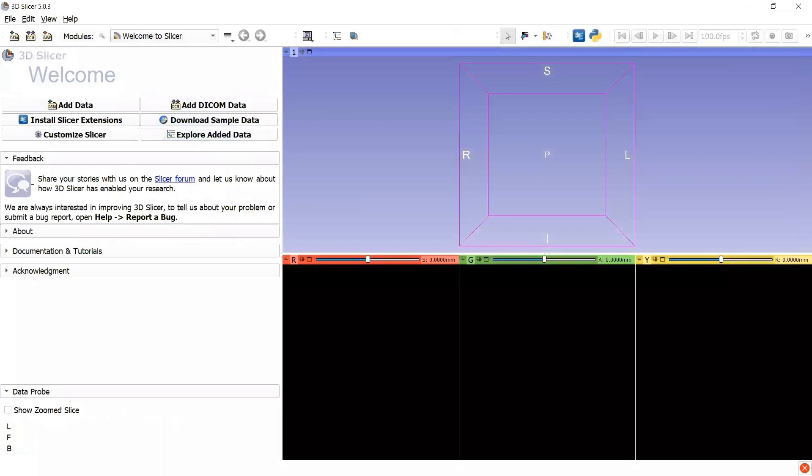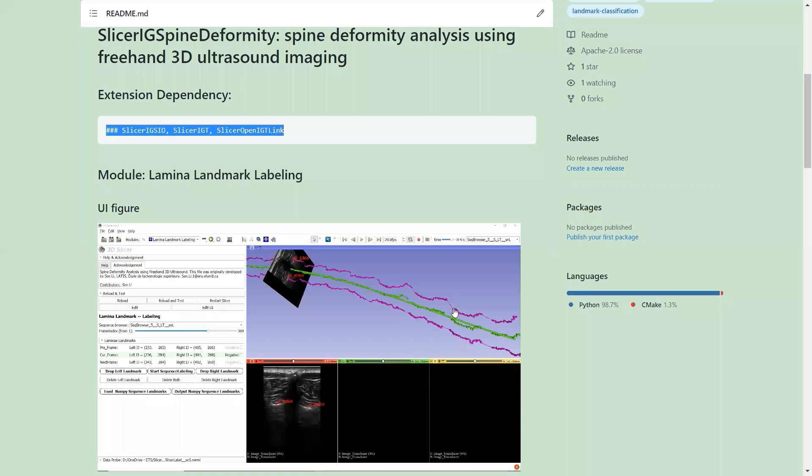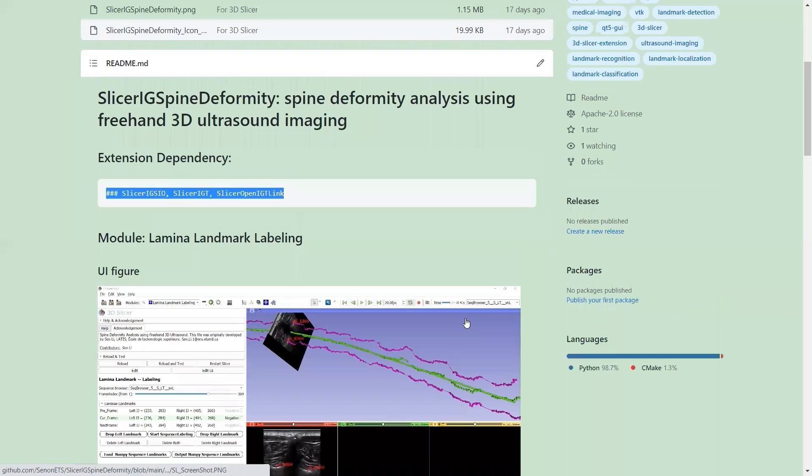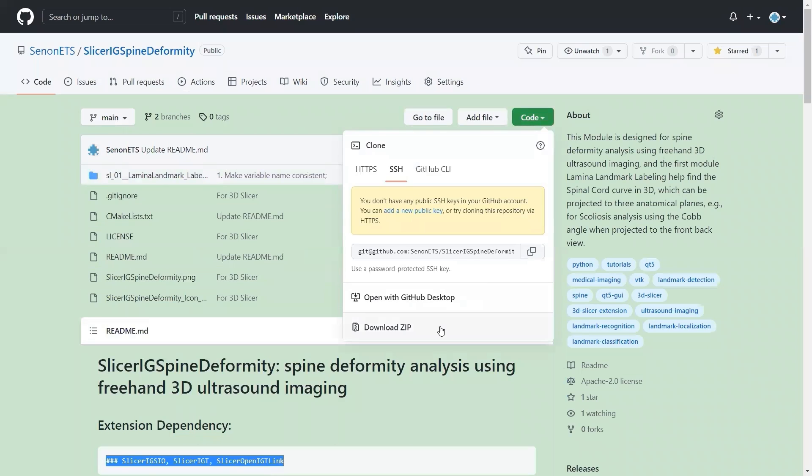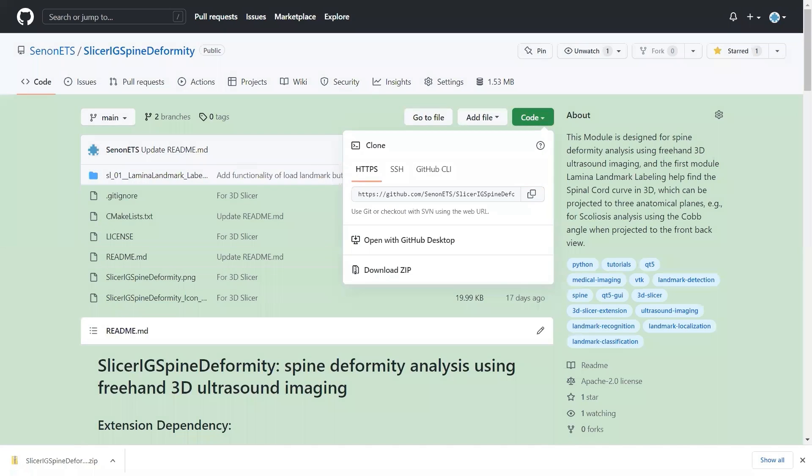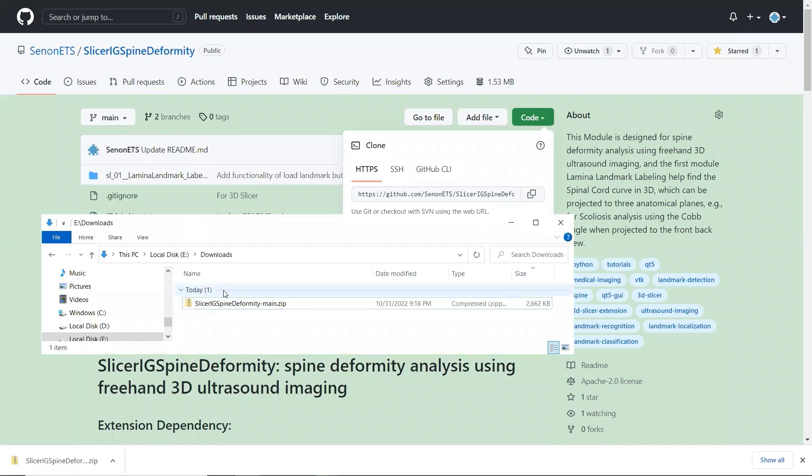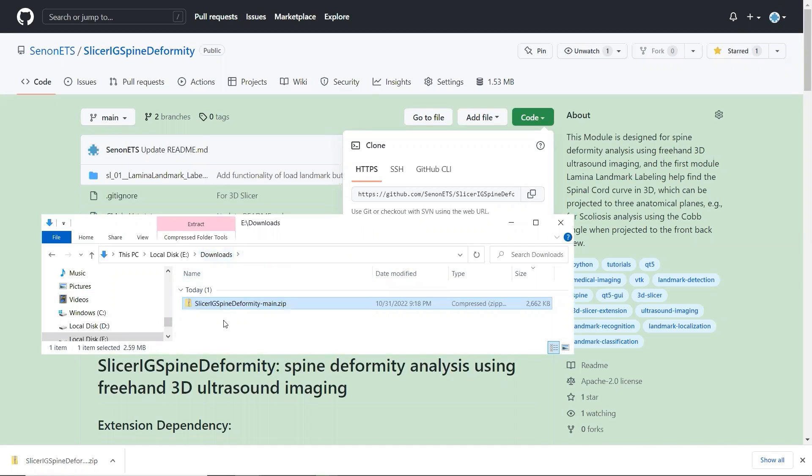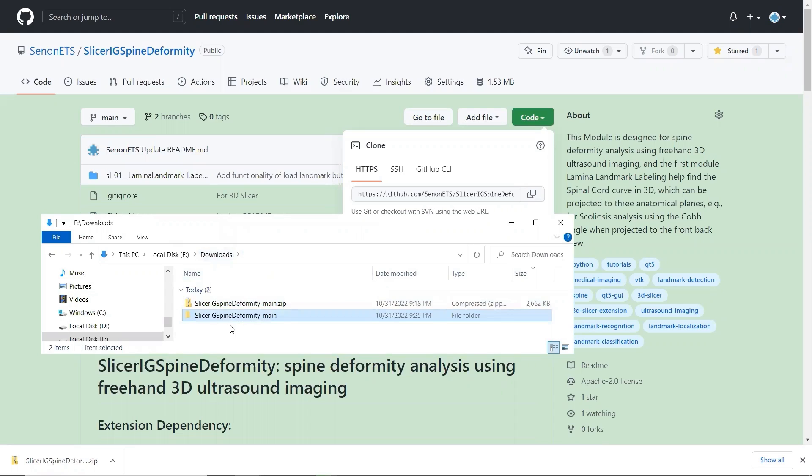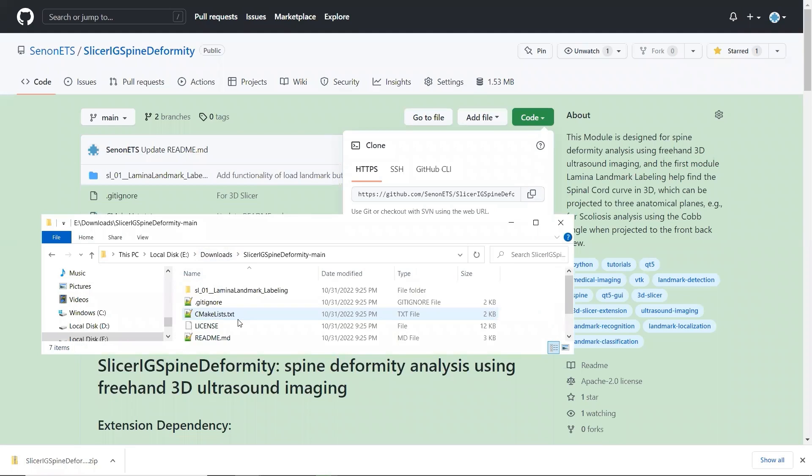Let's go back to the GitHub repository and download the extension code SlicerIGSpineDeformity. In File Explorer, unzip the downloaded file and make sure the extension files are in a folder.